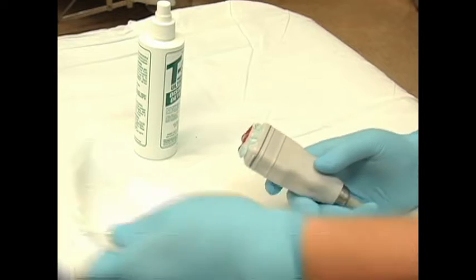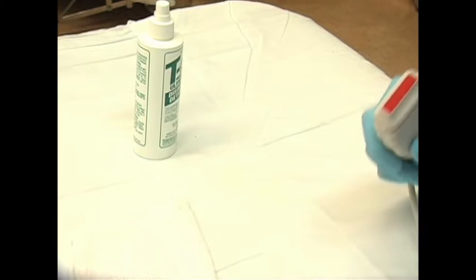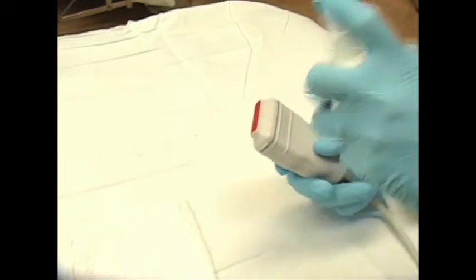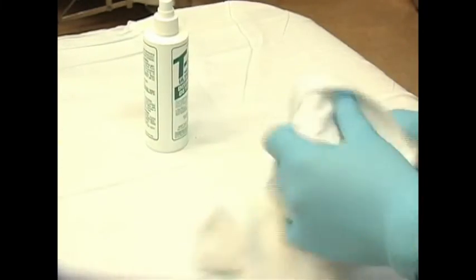Once the procedure is done, we need to make sure we wipe the gel off the transducer, spray it down with T spray, and wipe it off to make sure it's ready for the next user.